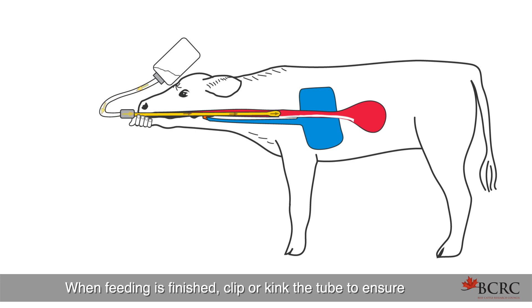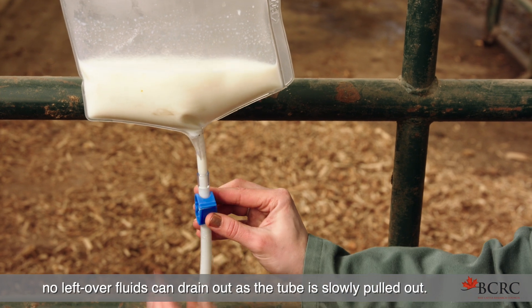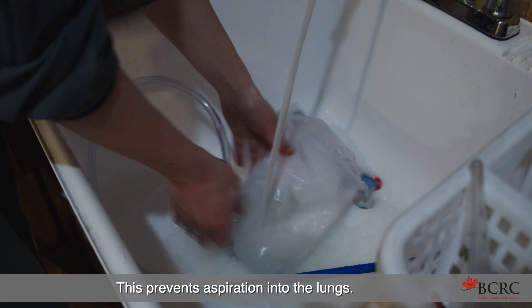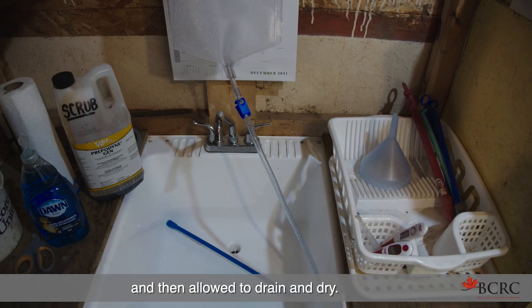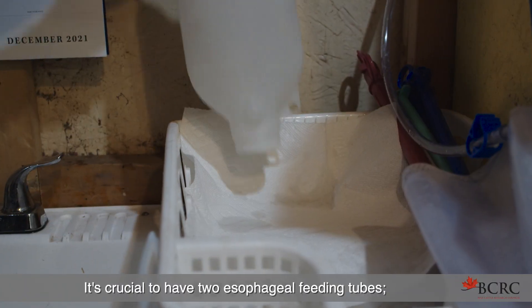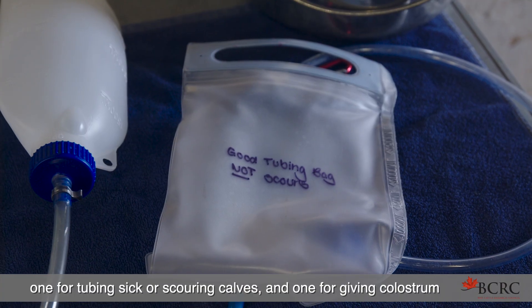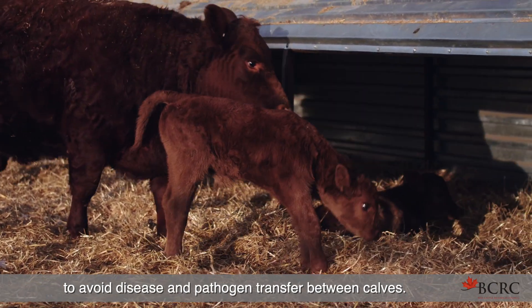When feeding is finished, clip or kink the tube to ensure no leftover fluids can drain out as the tube is slowly pulled out — this prevents aspiration into the lungs. The tube should be cleaned, sanitized, and then allowed to drain and dry. It's crucial to have two esophageal feeding tubes: one for tubing sick or scouring calves, and one for giving colostrum, to avoid disease and pathogen transfer between calves.